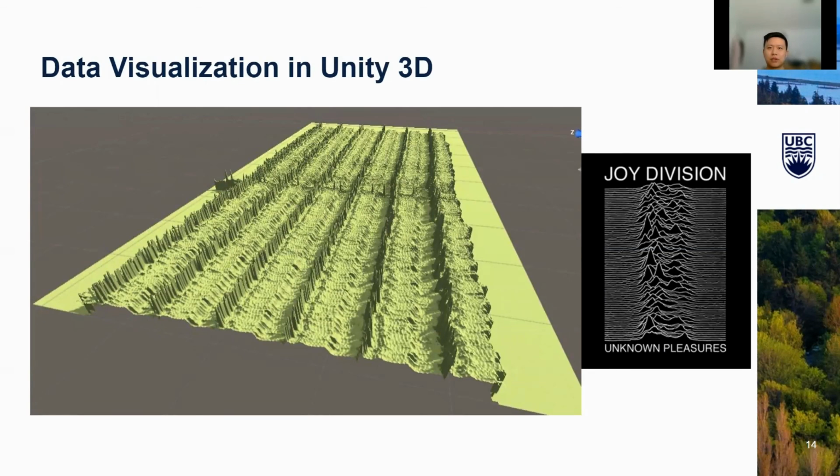And that's the machine learning part we worked on this summer. Here is what it looks like in Unity 3D, next to a more famous example of time series analysis.